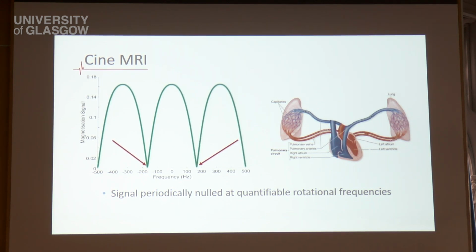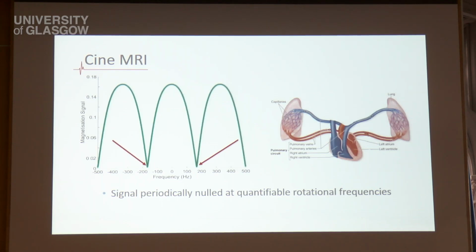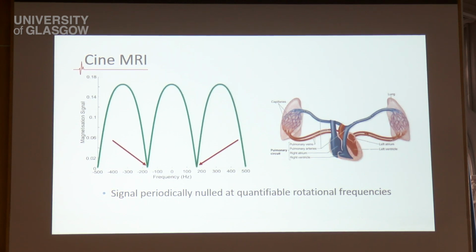Well, as blood is flowing up and round through the lungs, it then enters a completely different chemical environment. The lungs are filled with air and lots of gases, and this makes hydrogen really excited, so it begins to spin faster or slower. Then as it returns to the left atrium, it's in this excited state, and the MRI scanner isn't expecting that. So it can't detect signal from it because it's no longer behaving at the Larmor frequency as expected.